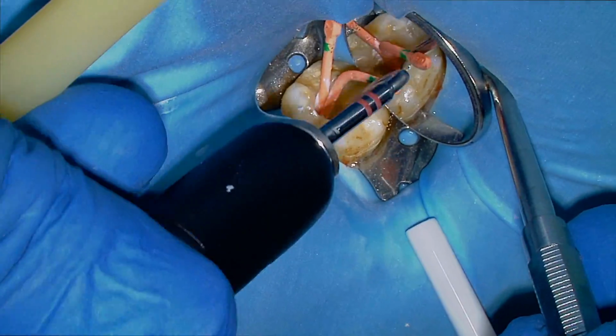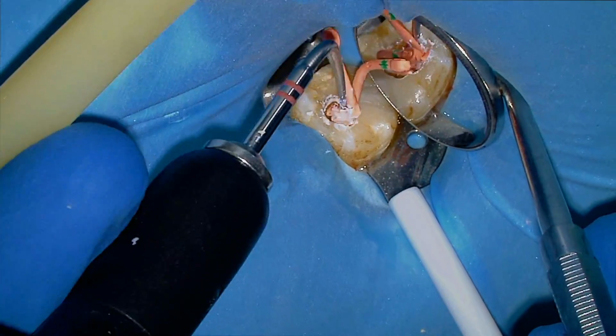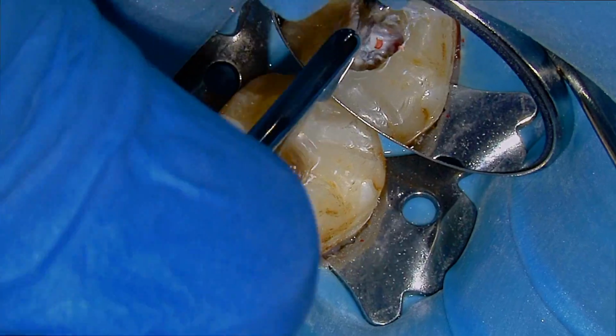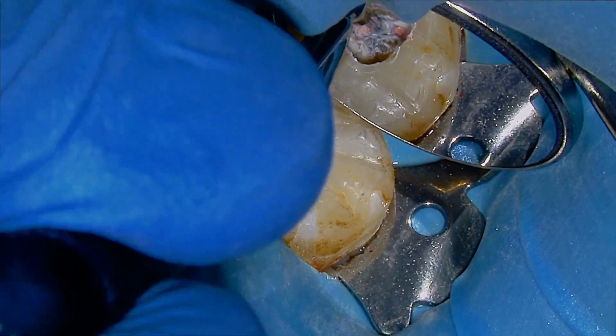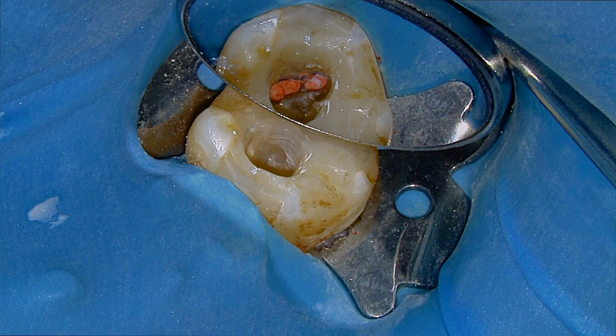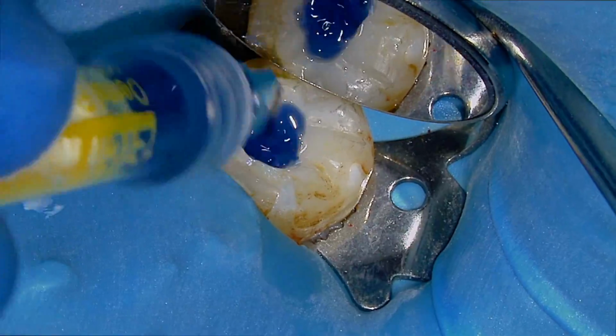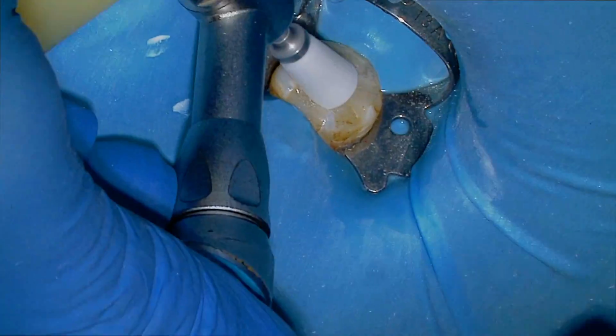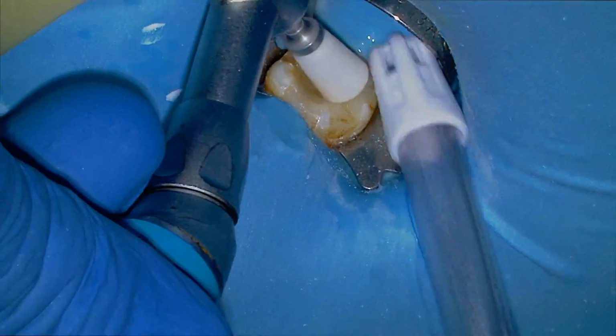We're going to sear off the orifice. This is a new heat source I've been trying. It's called a B&L, and it actually is really cool. It's cordless. And then we're going to pack it down, and voila, we've got our newly refreshed mesial canal. And we're going to place our bonding agent, and then we're going to seal up with some composite, finalize the last increment, cure it, adjust our bite, our occlusion, polish the restoration, and then that's it.